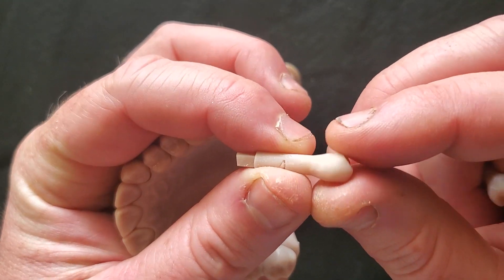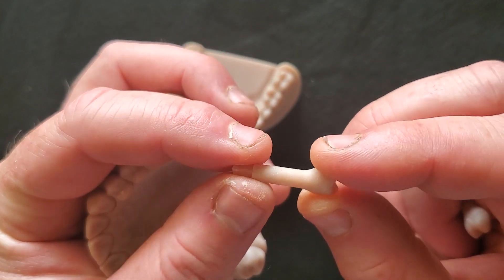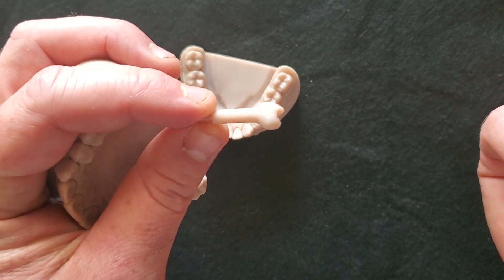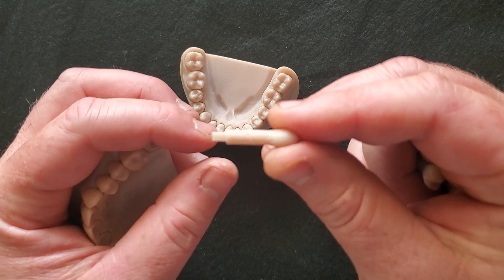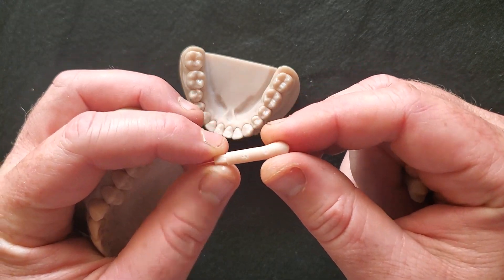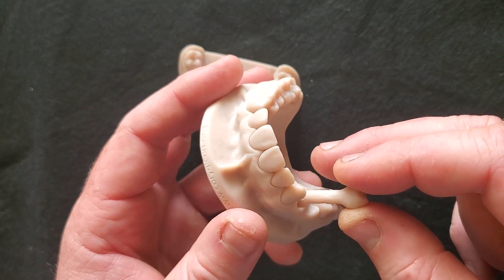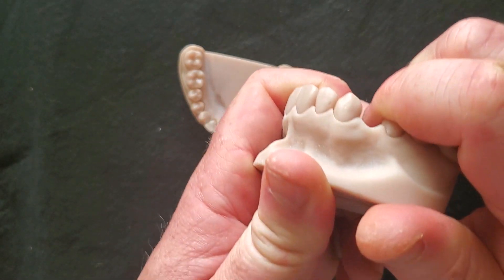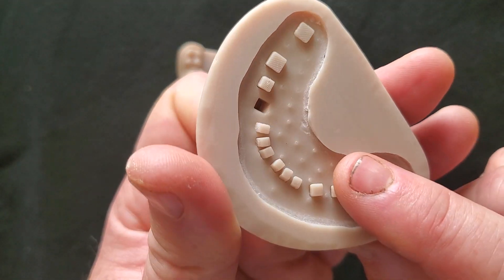These are the teeth — they're all labeled, which makes it easy to match them up when you go and print more. Or if you've printed a whole arch and need to know what's what, you can simply look at the number inscribed into the peg. That matches up to the site on the model, and you just push them in.